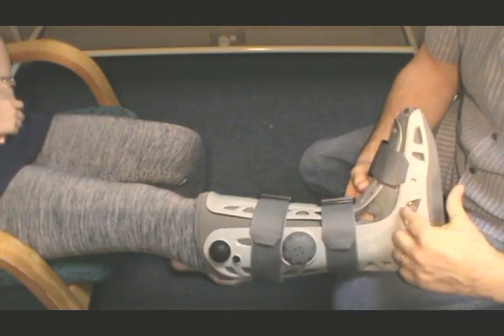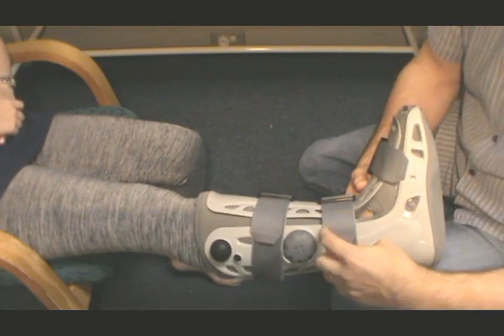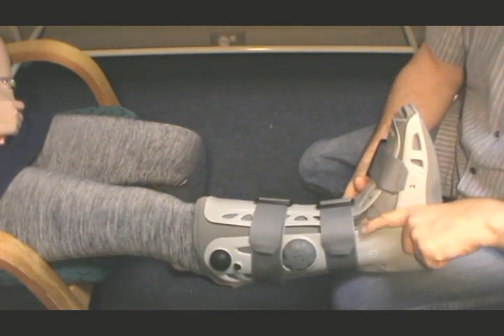so if you have a look at these boots, all these boots come with an airbag. And the airbag goes all the way up to there and goes all the way around here. And this sits on the inside of the boot. There, it's sticking out there a little bit.